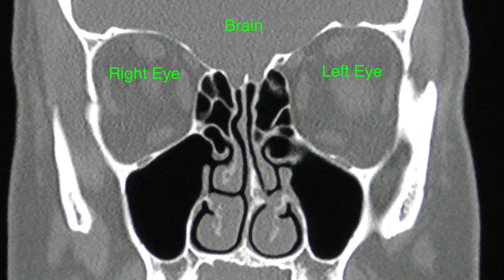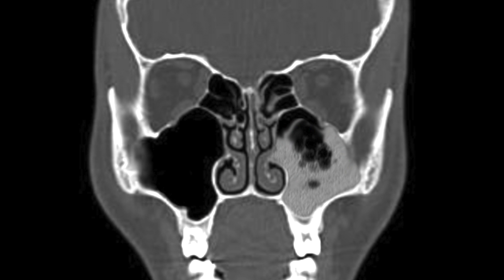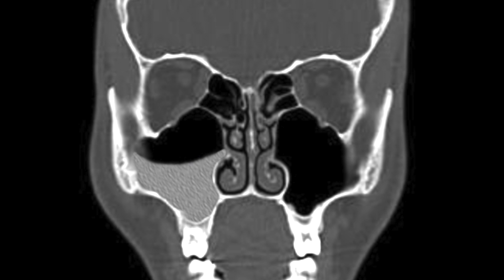Just like the black color around the head is air, a normal sinus cavity should contain only a black color as well. If an active sinus infection is present, there would be a gray discoloration within the sinus cavities with either air bubbles as shown in the left maxillary sinus cavity, or an air fluid level as shown in the right maxillary sinus cavity here.